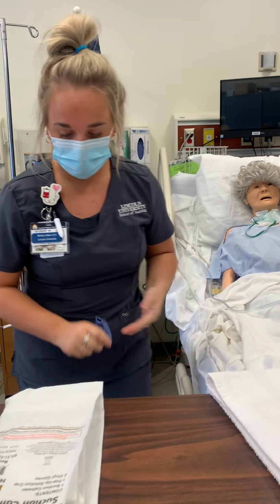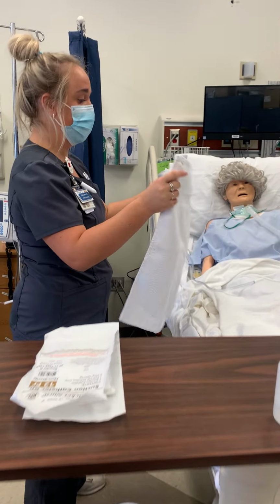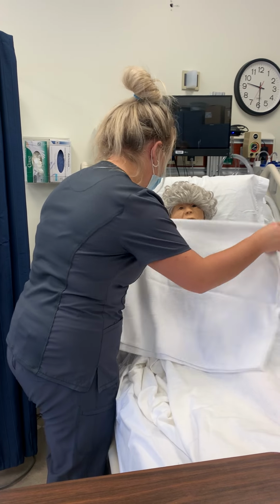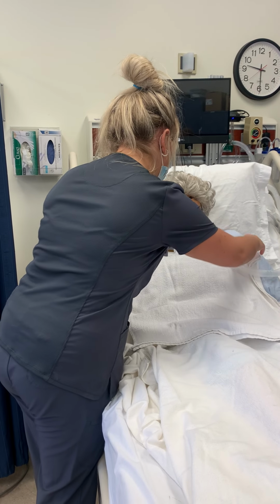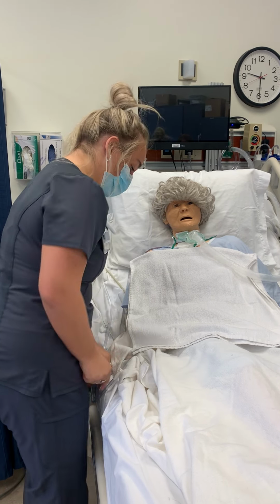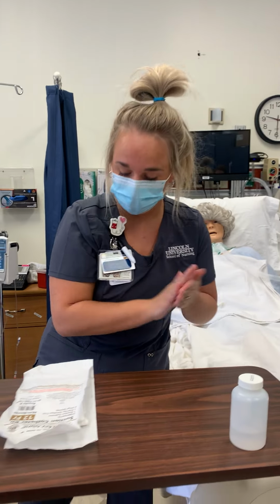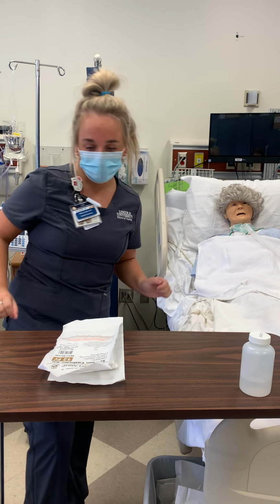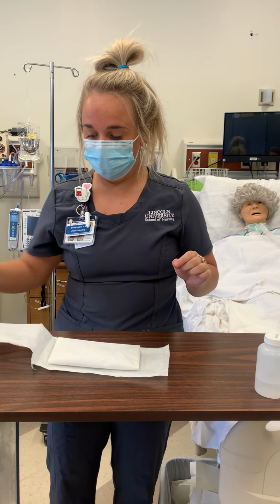Okay. So after I've done that, I'm going to go ahead and put this towel on her. This will just catch any of those secretions in case they were to fall out. All right, Miss Smith, I'm going to put this towel right under you, okay? Okay. Do hand hygiene. Okay. Open my kit.